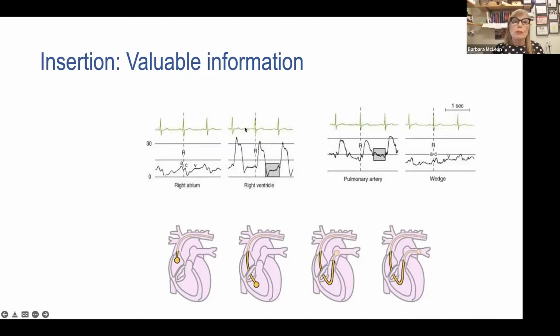You can see a pulsatile pressure in the right atria when you have tricuspid regurgitation, and you can see a pulsatile pressure in the wedge when you have mitral regurgitation, because instead of blood going forward, it's going backwards, and it's doing that with every ventricular contraction, okay? In between there is the right ventricular pressure, which is a combination of arterial and venous or filling.